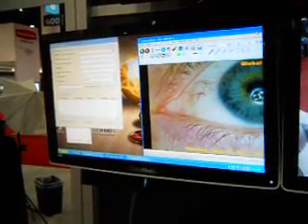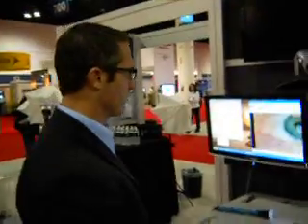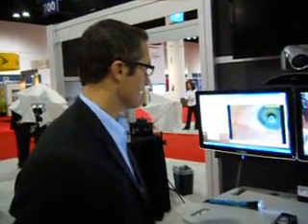So this is very different, much like what you're seeing. Right. And so we can pull this up, and now we're able to give you evidence of the consult, any complications that you may discover. Right. You know, wow, I can actually code for a more in-depth examination. A more complex code. Right. So this image actually can be saved in what we call a DICOM format, and then incorporated into a health record, incorporated into a presentation or a case note.